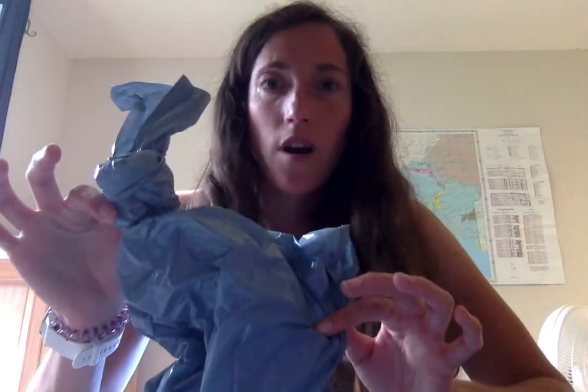From here, I progressed more to using these wag bag systems where you have the outer bag and an inner bag that you can empty your ostomy right into. Other people use these as well on wilderness trips, especially if you're in an area where you have to pack out your stool. So this works well because you can just empty the contents of your ostomy into this inner bag, and this one has some deodorizing and absorbing crystals in it.